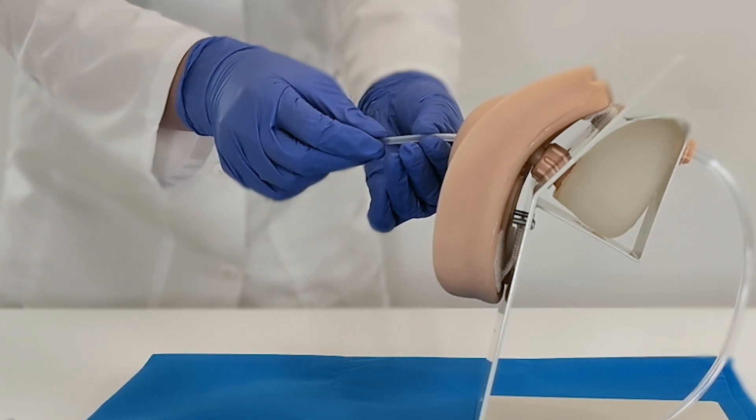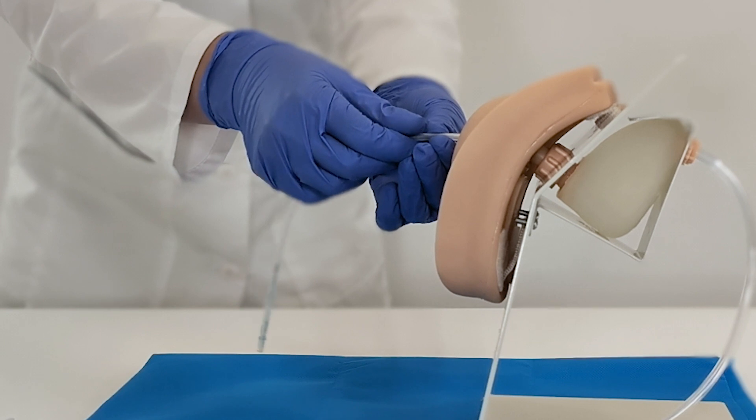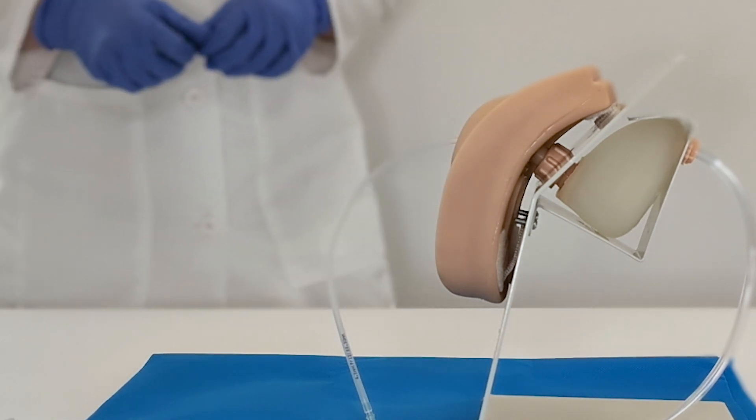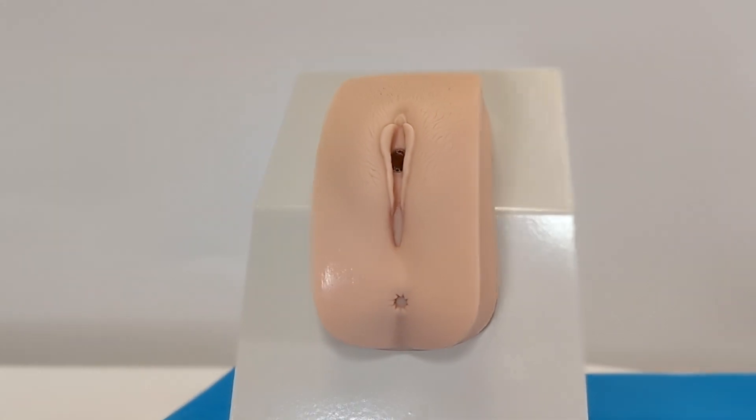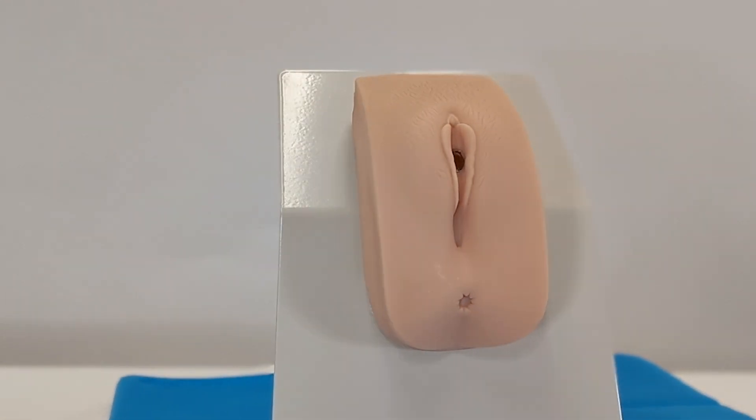The female model includes anatomical landmarks critical to understanding the correct orientation and positioning of the catheter, including the vagina, labia minora, labia majora, and clitoris.